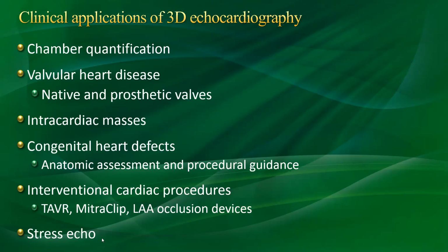Stress echocardiography is also an evolving field. There's some limitation due to the frame rate and the temporal resolution, but it's something I expect in the next few years we're going to see more practical, because if you think about it, in one beat, you can assess, for example, if you're doing the short axis, the basal, mid, and apical views in a short axis. And with your apical view, you can get your 2-chamber, 4-chamber, as well as apical 3-chamber, if you scan the patient twice. So it's very exciting to see how that field is evolving with the development of the technology.